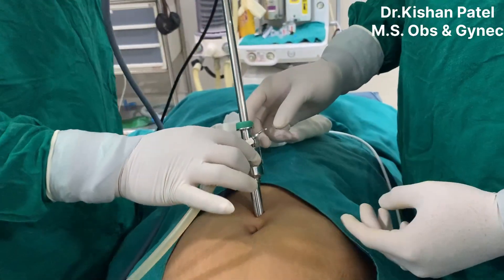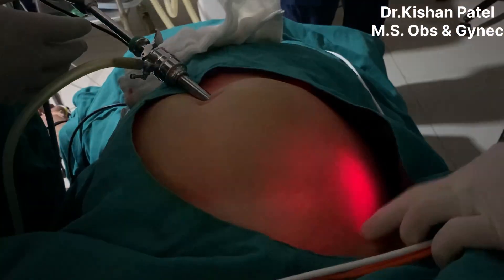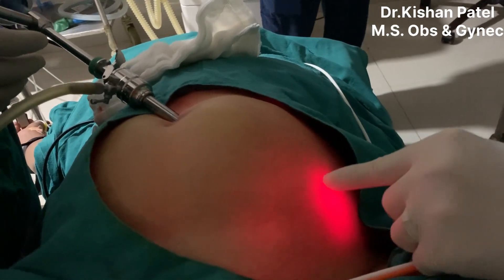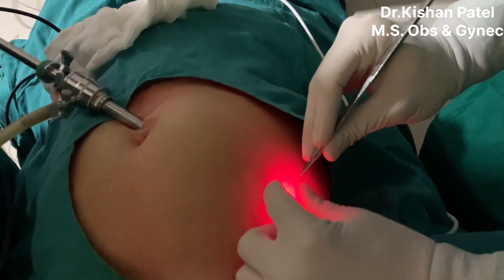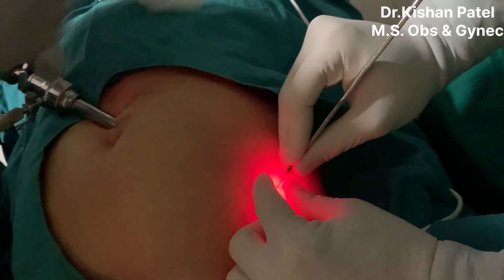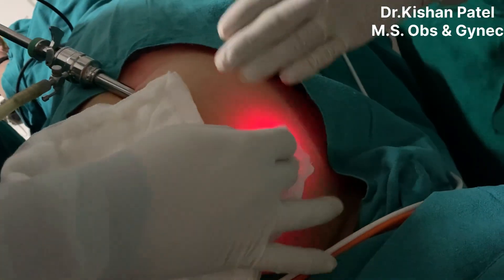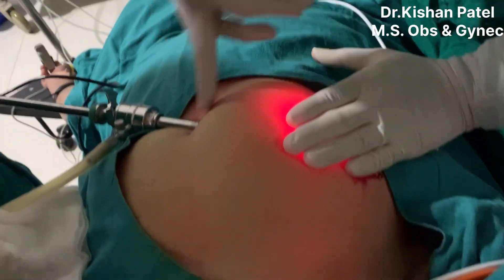We will start the CO2 gas and begin inflating. Once your port is at 90 degrees and in the space, confirmed it's in the right direction. Now the minor port: 2 centimeters above and 2 centimeters medial to the anterior superior iliac spine — the ASIS — using a 5mm port. We will make an incision of 5mm for the minor port.